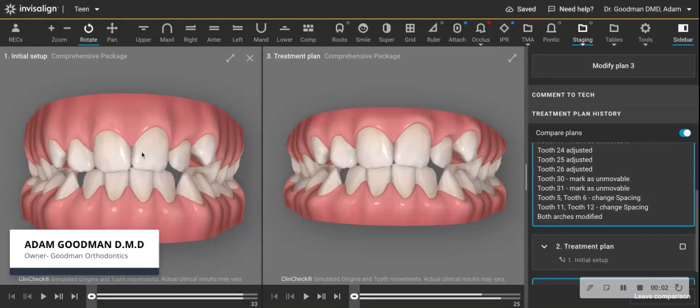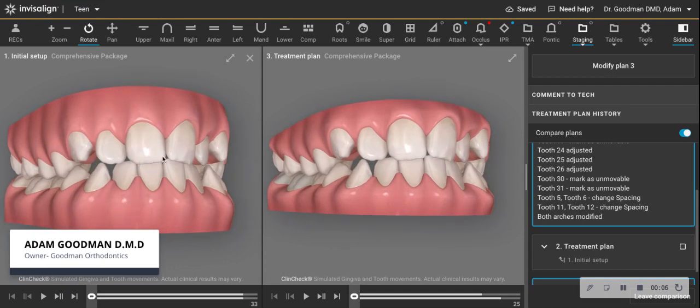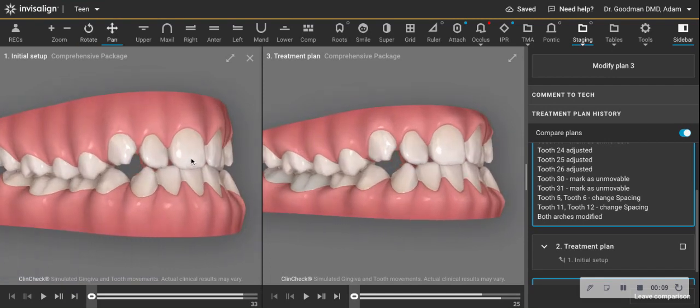Hello, colleagues. I want to show you two ClinChecks: one that came back from Invisalign that I think was not realistic, and one with a simple modification to make it more predictable.